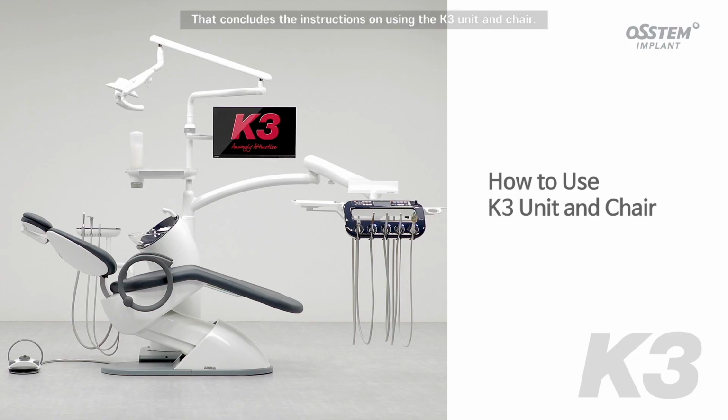That concludes the instructions on using the K3 unit and chair. Thank you.